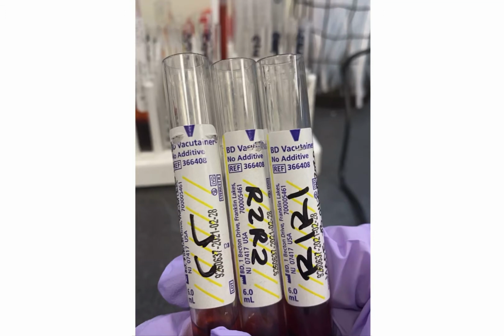To begin our discussion about the adsorption procedure, I'll show you a short video of an allogeneic adsorption. In an allogeneic adsorption, we typically take 3 cell lines for a screening measure. Each of the cells represents a different donor, and each donor has a different phenotype. We can use their phenotypes to adsorb out antibodies, and plasma will remain so that we can test the plasma for antibodies while others are adsorbed onto the red cells.